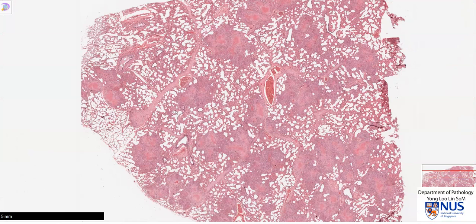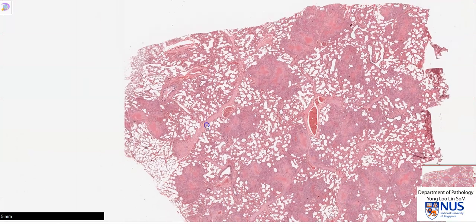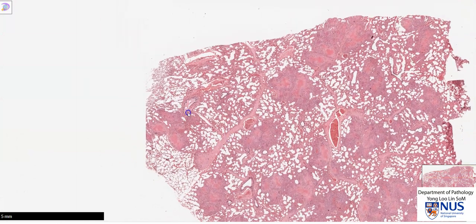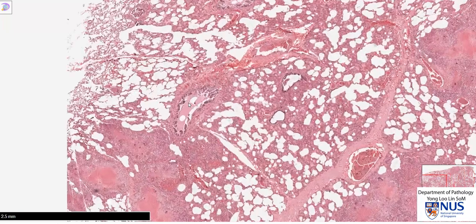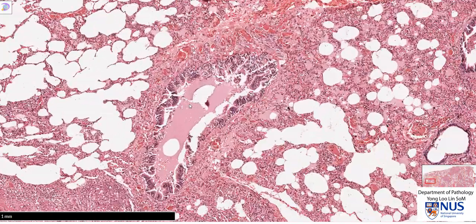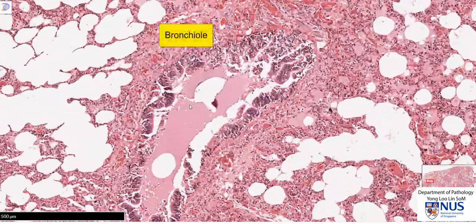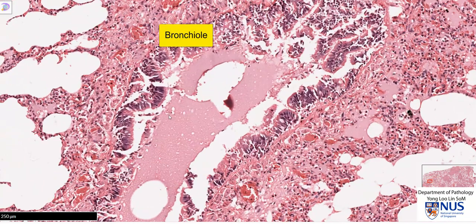Let's zoom in to a particular area. Here is a recognizable bronchiole, and we can see that it is lined by ciliated columnar epithelium.